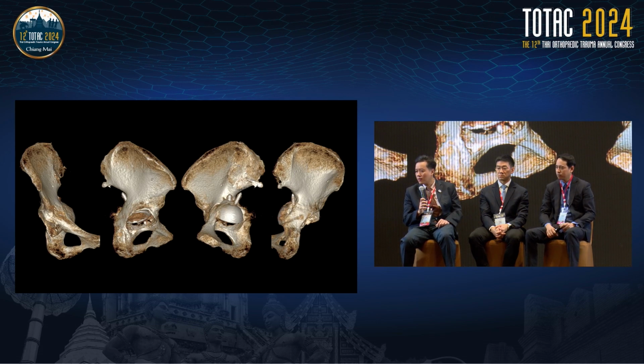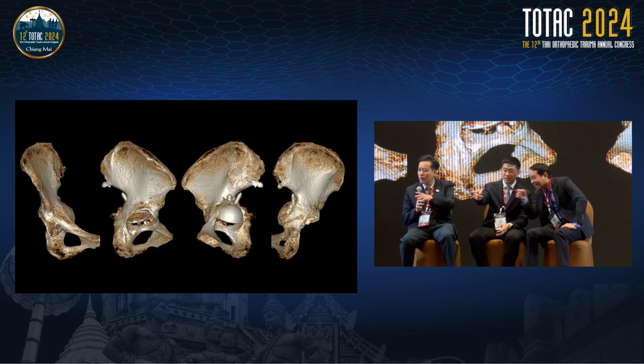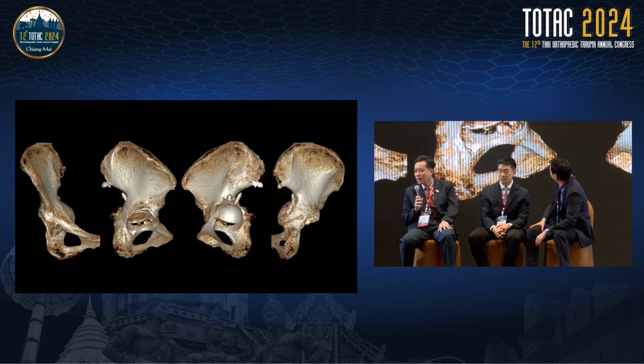As Dr. Gulapat mentioned about the fracture of the posterior column, is there any fracture line at the posterior column? No, just only protrusio. Only protrusio. So yes, I have addressed all the issues about the acetabulum already. So could you go back to the femoral fractures?